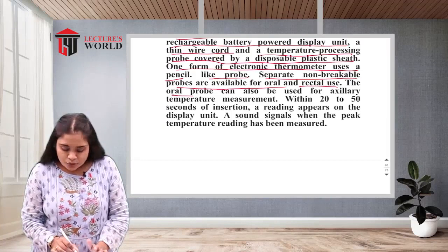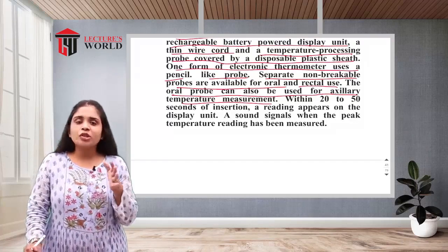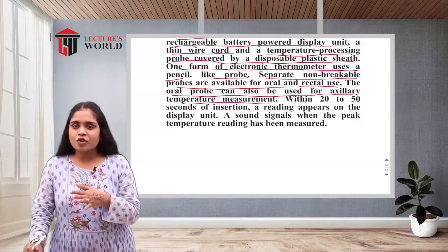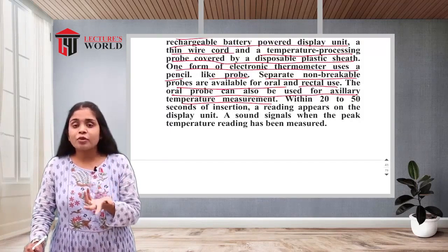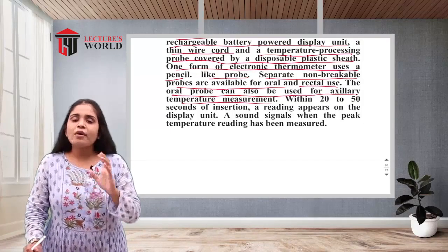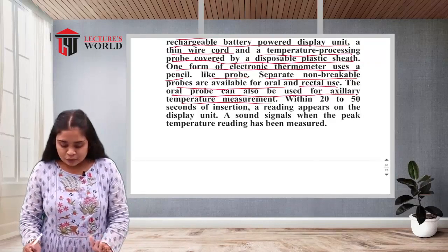So the oral probe can also be used for the axillary temperature measurement. If the oral probe is there, you can use that for the axillary temperature also. It is not necessary that you should have another separate probe for the axillary. If you have the oral probe, you can use that for the axillary purpose also.